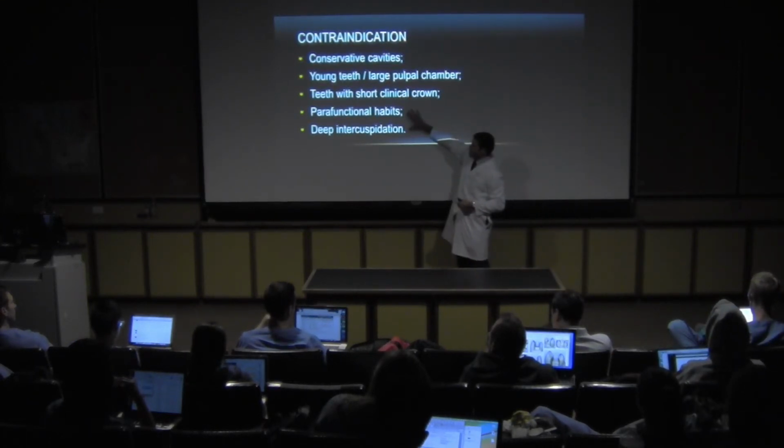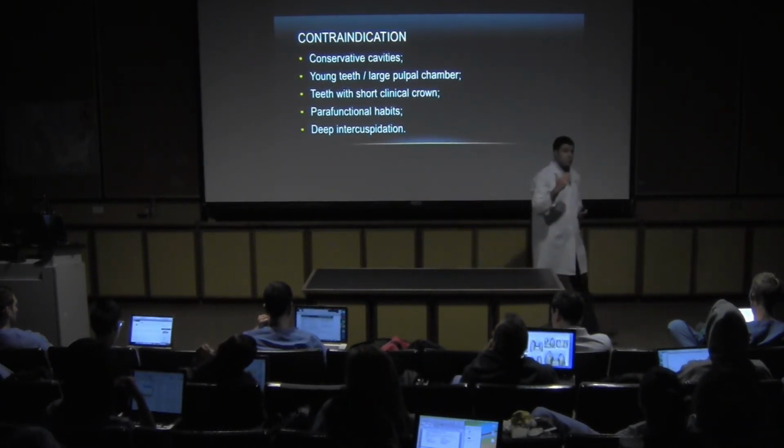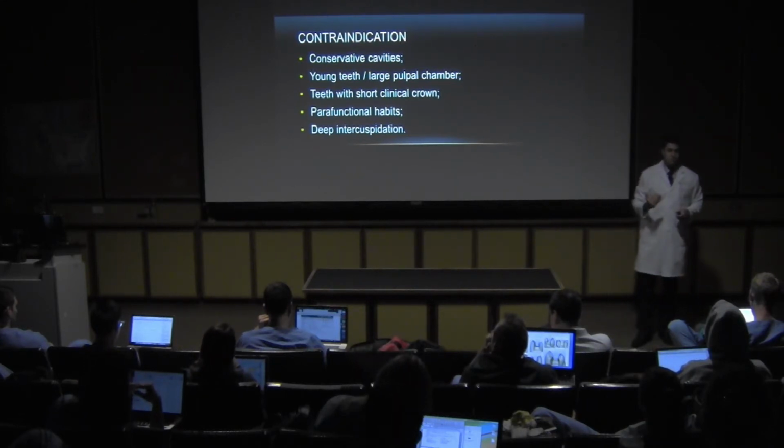And parafunctional habits and deep intercuspation, it's the same thing, it's a contraindication because the material is brittle. So it could fracture.